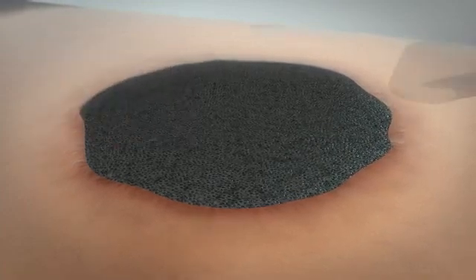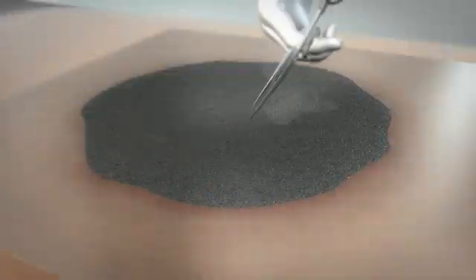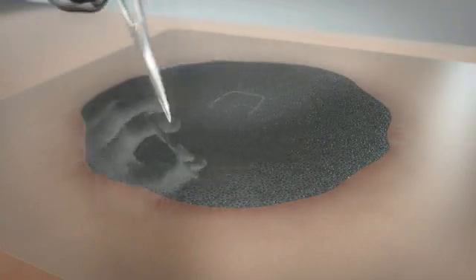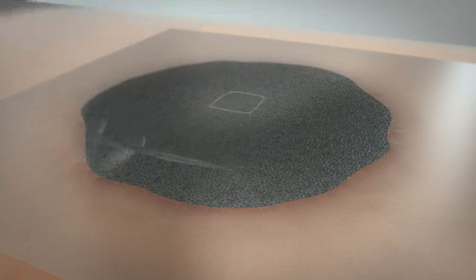A drape is used to cover the dressing. A hole is then cut into this drape before the patented TRAC pad is placed over the drape to seal the wound and connect it to the therapy unit.